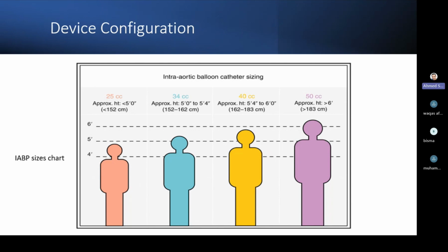Yeah. And I remember last time, that patient was in S4. I don't know who of you attended this case, but they brought the patient from the cath lab. His height was around 180, and unfortunately they put in a 30cc catheter for him.